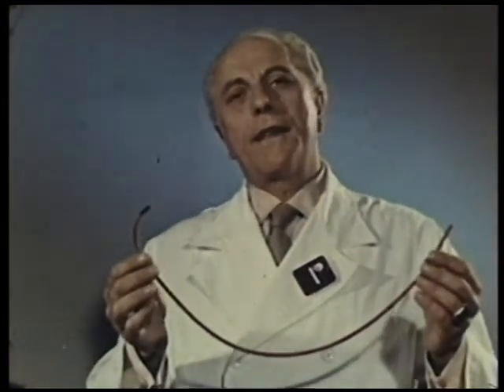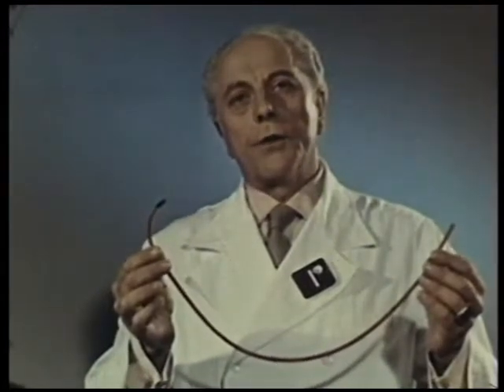Finally, this catheter is suitable for displaying the apical branch of the right lower lobe bronchus, which can also be filled separately.